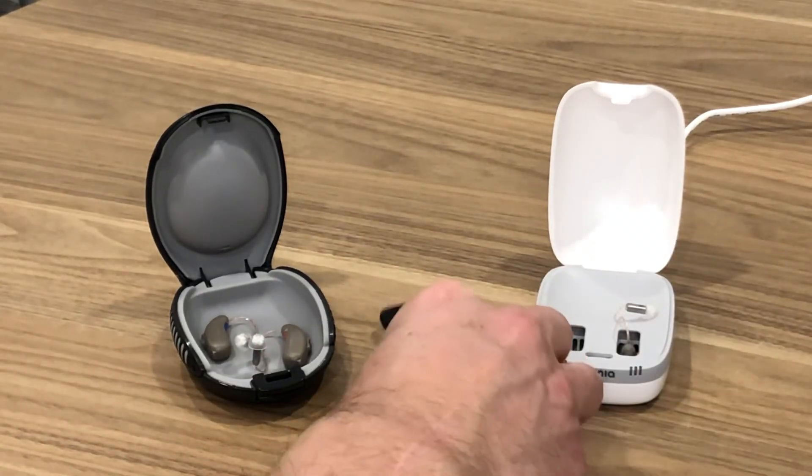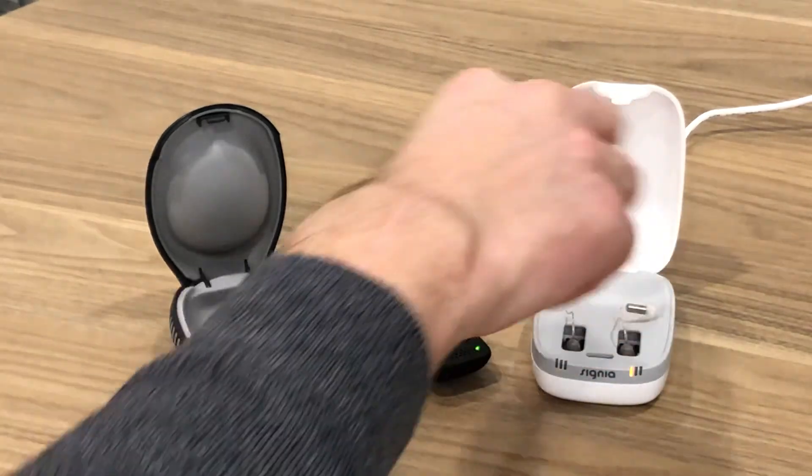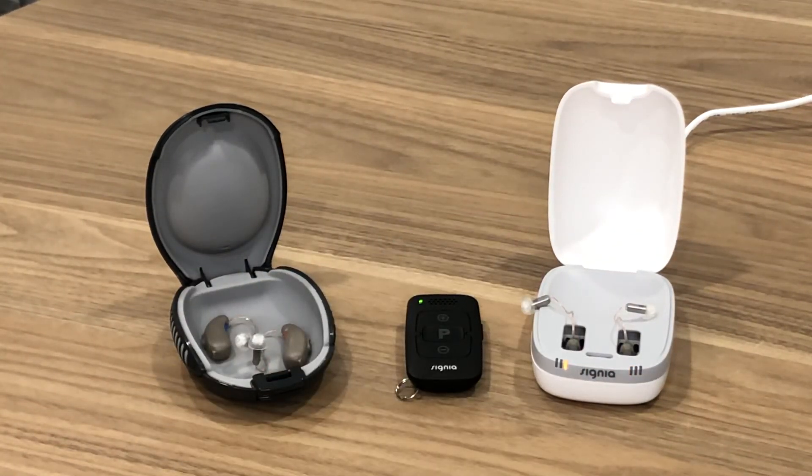So there you have it — that's how we pair our Signia hearing aids to our Signia mini pocket remote. Hope you find this helpful, thanks for tuning in.